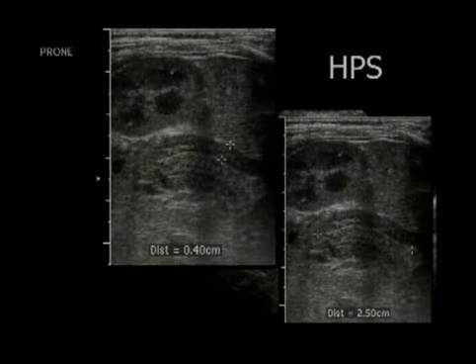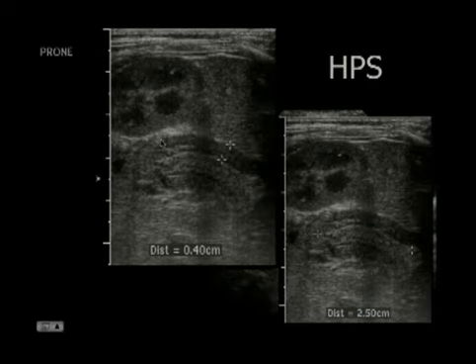So again, you can wait or you can turn them over, and here we're scanning through the back. Here's tip of liver, here's kidney, and we're able to see the pylorus very nicely, see that the muscle thickness is well over 3 millimeters and the channel is well over 1.6 centimeters in length, and you've now made the diagnosis much more efficiently.